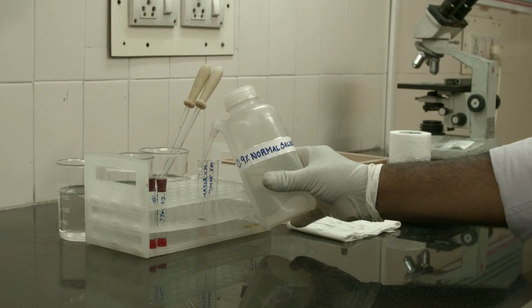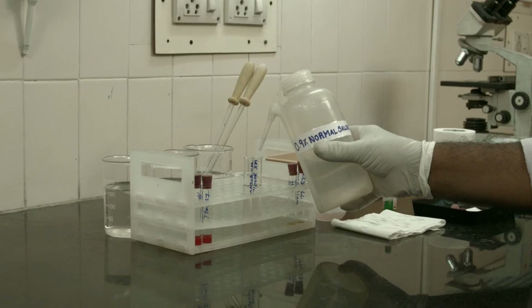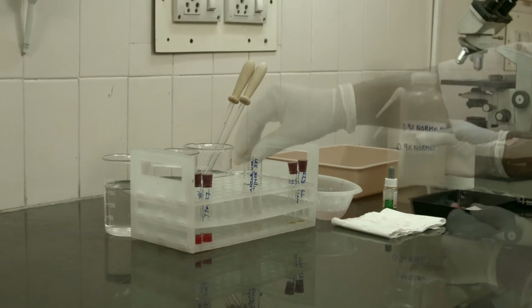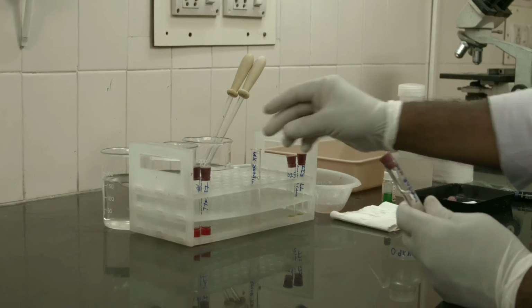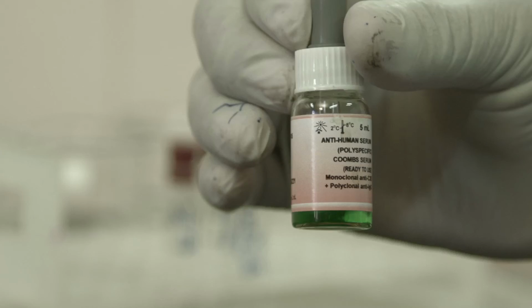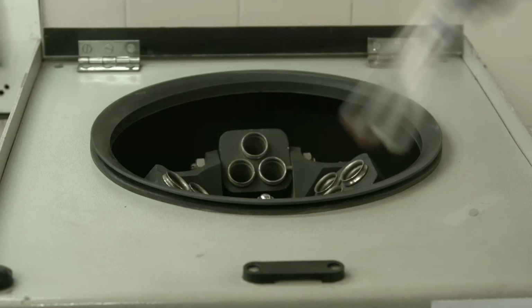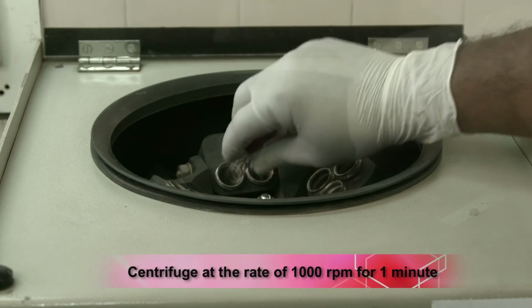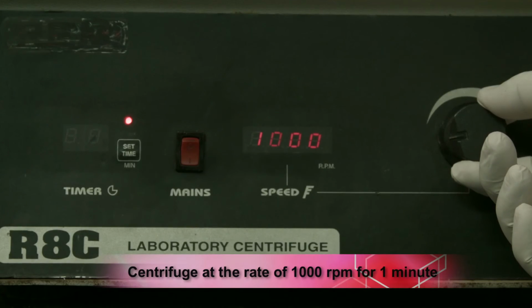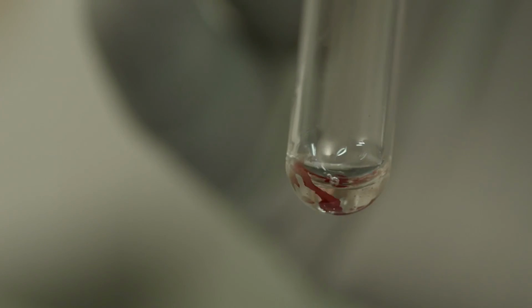If there is no hemolysis or agglutination, wash the cells 3 times with normal saline and completely decant the last wash. Add 2 drops of polyspecific anti-human globulin (AHG) reagent to the dry cell button. Centrifuge at the rate of 1000 rpm for 1 minute to look for agglutination. Record and interpret the results immediately.